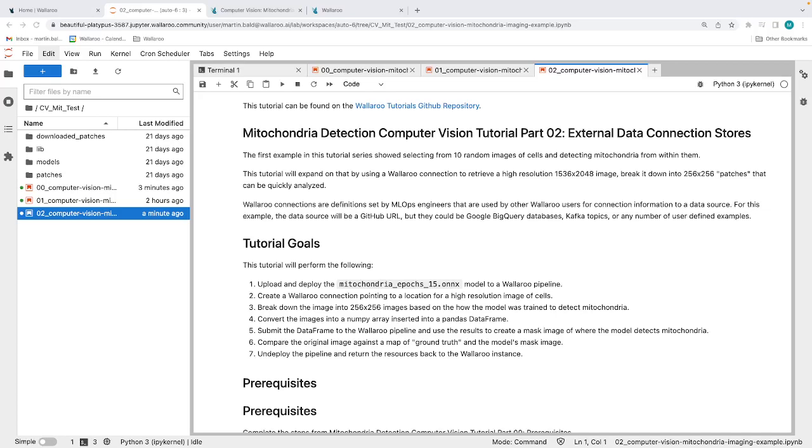This can be used in a number of different ways in a health example for cancer cells, other ailments, blood clots, etc. It allows health professionals an opportunity to quickly, in some cases, diagnose certain situations for patients using this technology.